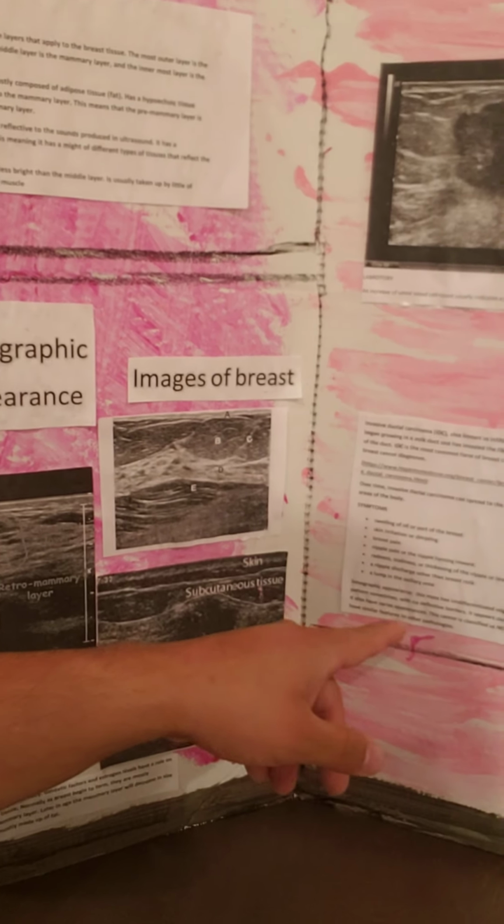Sonographic image appearance of this mass is undifferentiated edges. Means like I said, it's kind of like a star. There's no circle or oval. It has no borders. This cancer also is subclassified. Like it's not just that type of cancer. It might fall under a different type of cancer. So that's why the need for biopsies for this needs to be done.